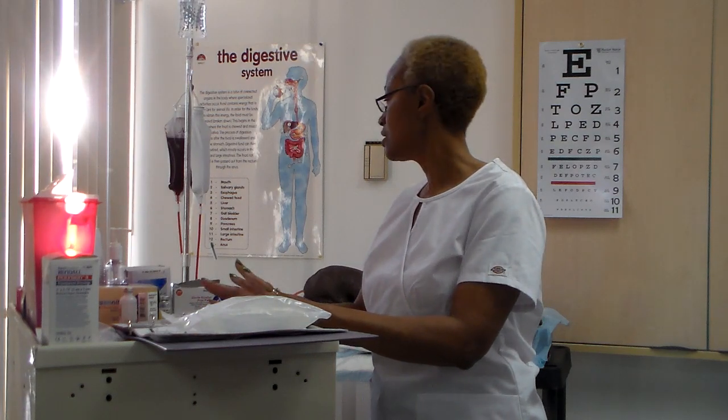Assess client's systematic fluid balance as reflected by skin hydration and turgor, body weight, pulse, and blood pressure. So that means you will go into your client's room and do an initial assessment on your client and then come back to your cart, making sure you've looked at his turgor, looked at the site, and that there's no swelling or anything, that the IV is infusing with no problems, and how their vascular system is at this time. Assess IV insertion site for signs of infiltration or phlebitis, and assess patency of existing IV line.